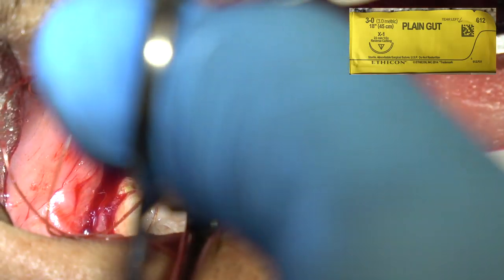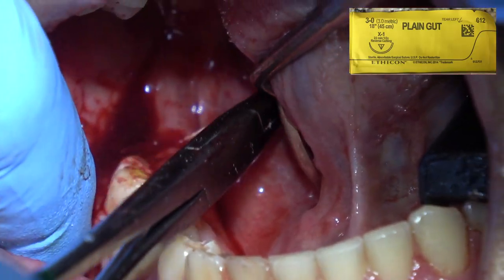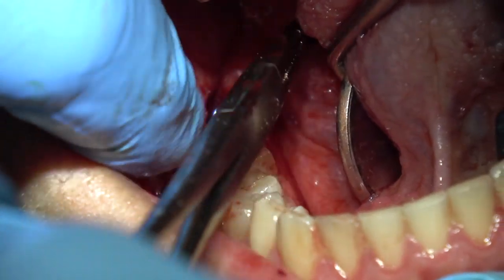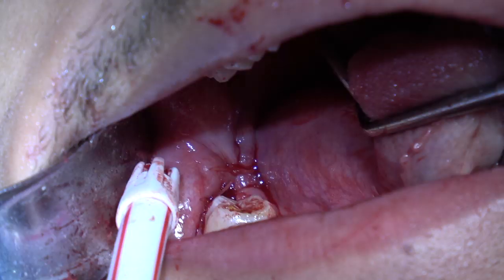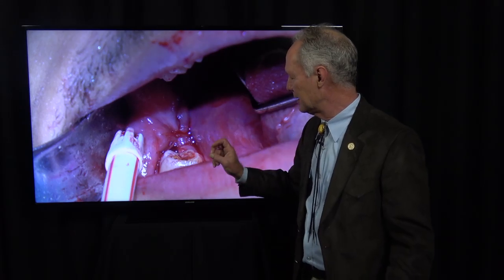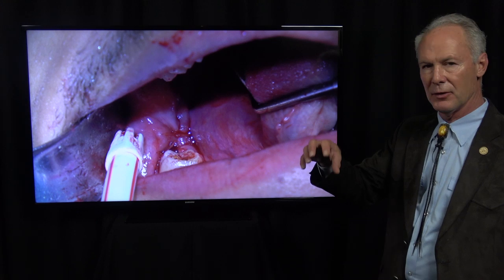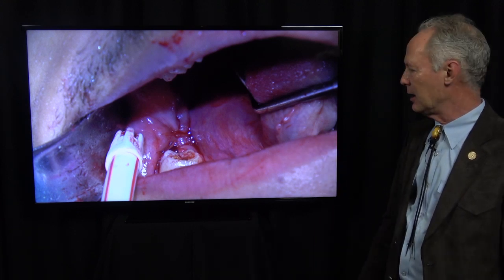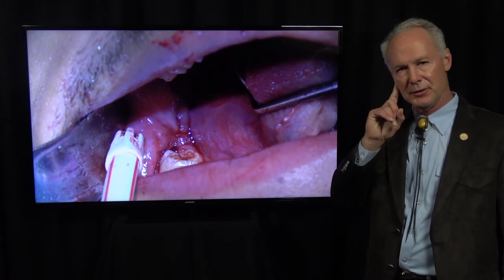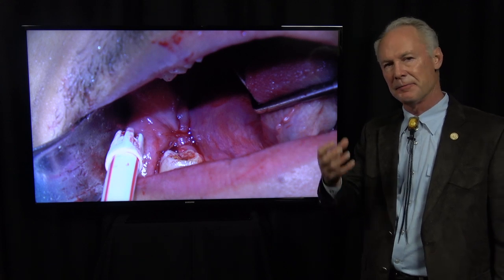Then I'm placing two 3-0 gut sutures in the mandibular extraction sites — one here and one here — to suture it tight. That helps hold the clot and resorbable gauze in the socket. I only use one suture on the maxilla. With the maxillary wisdom teeth, you don't have to pack those sockets, because for some reason you don't ever lose those blood clots and you don't get a dry socket there.